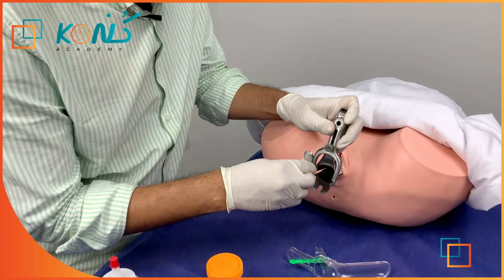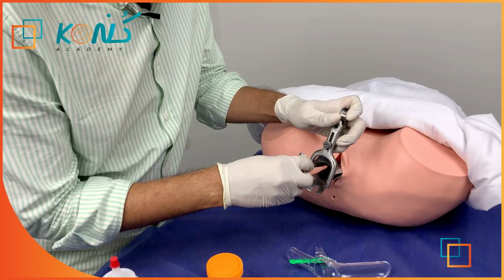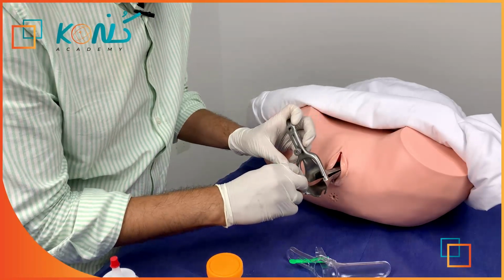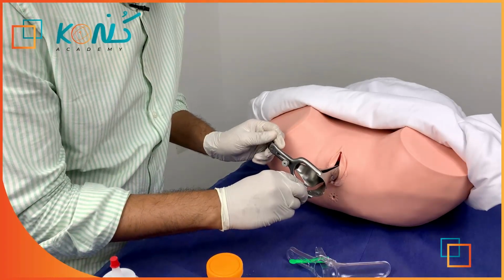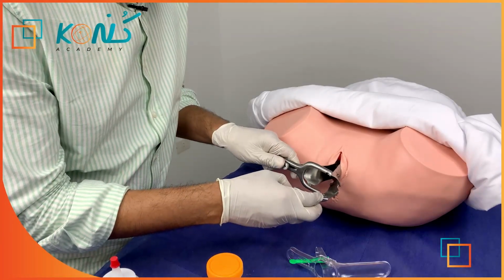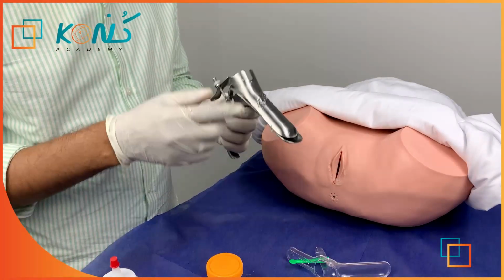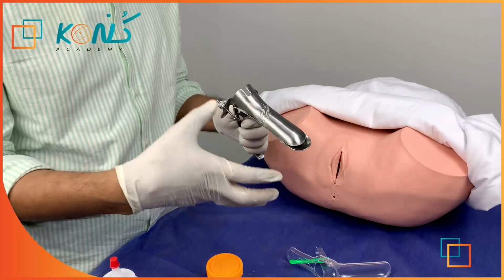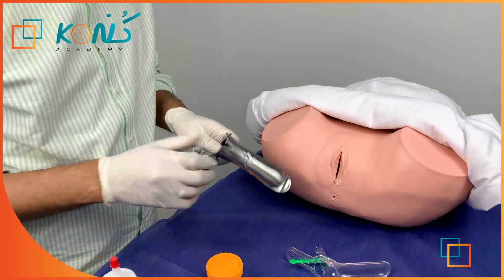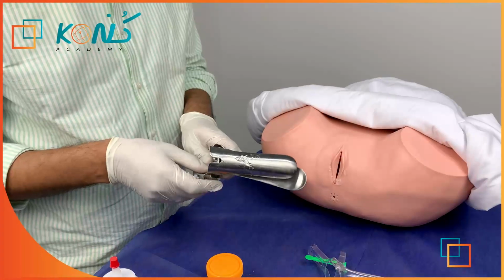Then you will just half close it. Half close after taking it out, and then you will rotate it like this as you have inserted it. Then you will totally close it before moving out, and you will take it out. You will have a look at it to see if there is any discharge or bleeding. Then you will thank your patient. If it is disposable, you will put it in the waste bin. If it is not disposable, you will put it aside, and it will be sterilized again.